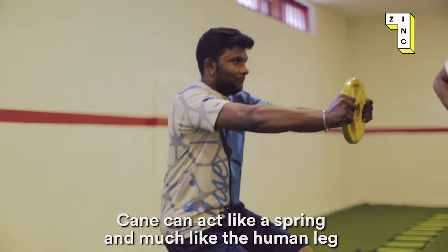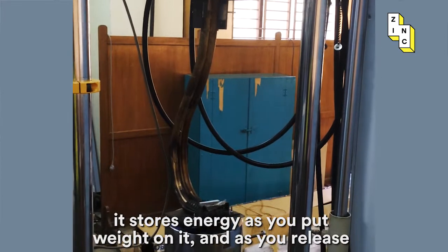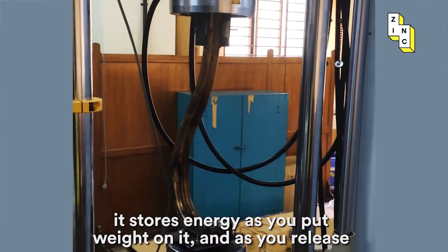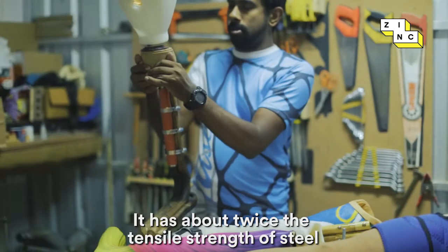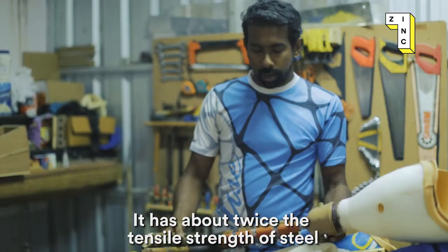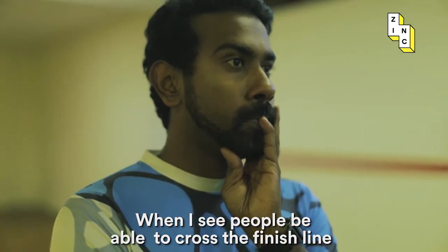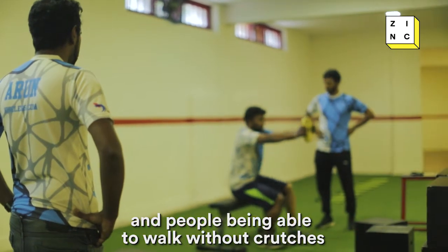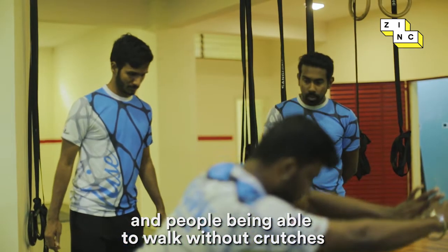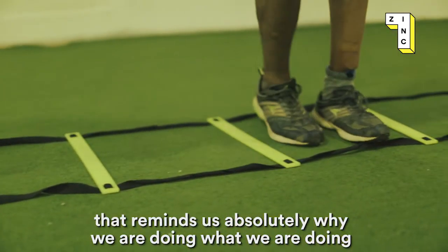A cane can act like a spring, much like the human leg. It stores energy as you put weight on it, and as you release it, it pushes off and gives you some assistance. It has about twice the tensile strength of steel at about half the weight. When I see people be able to cross the finish line and walk without crutches, that reminds us absolutely why we're doing what we're doing.